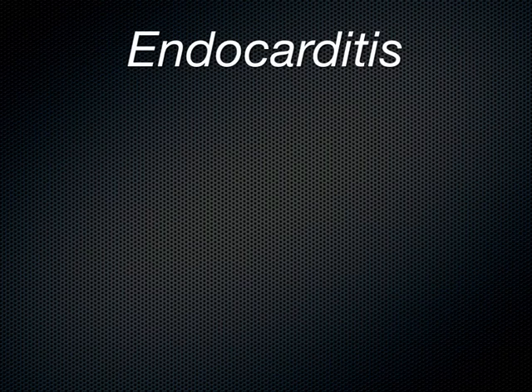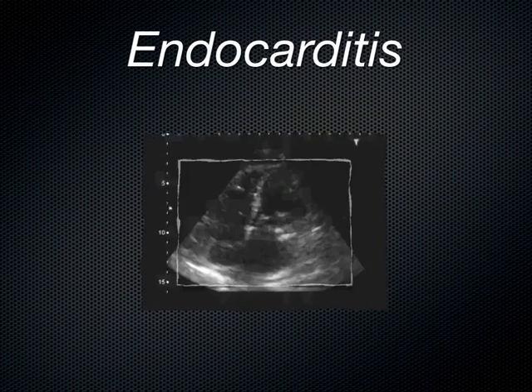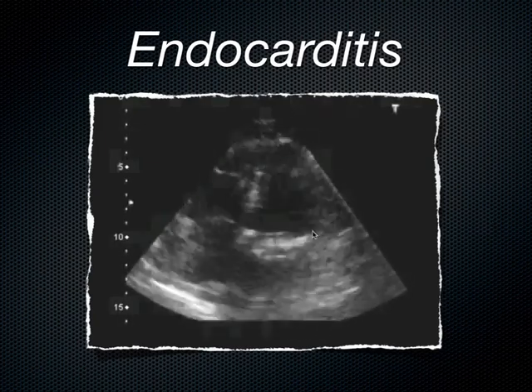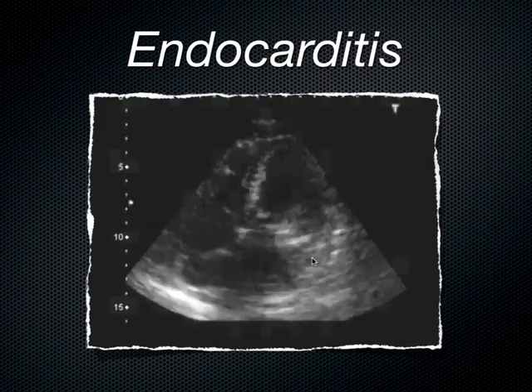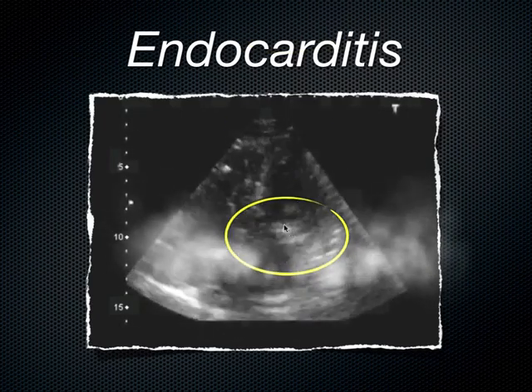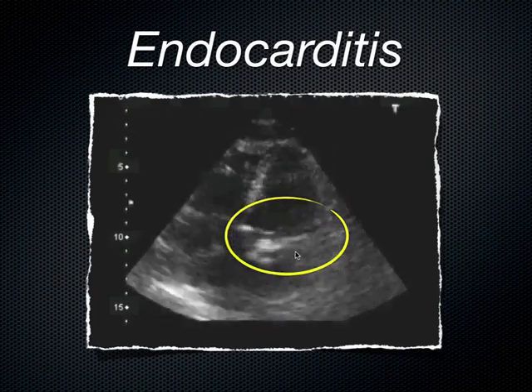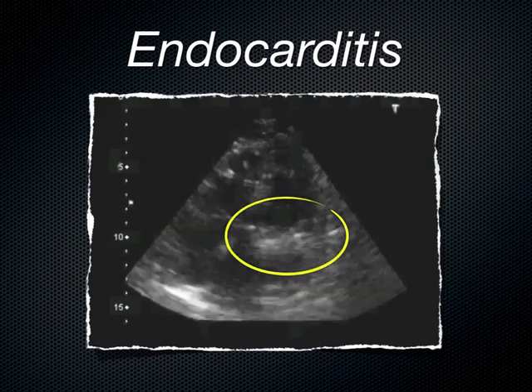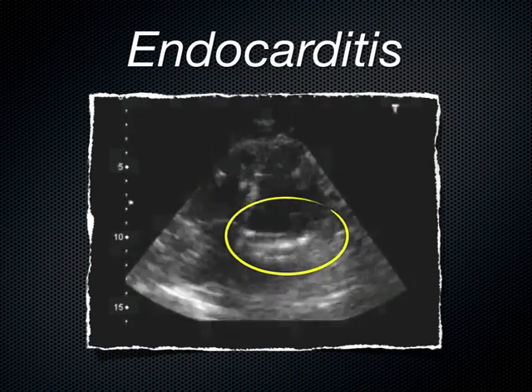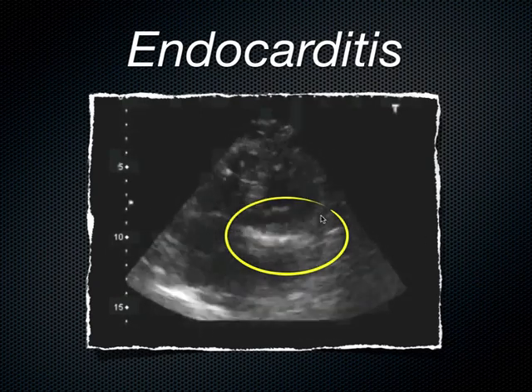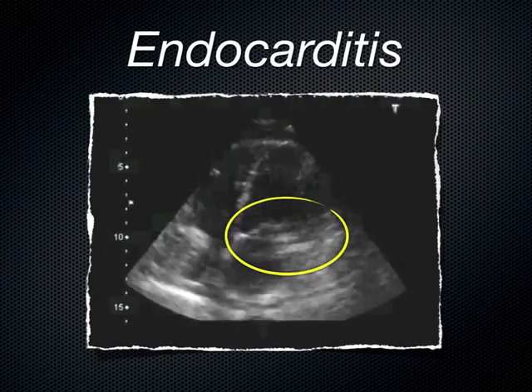Moving on to another cause of fever: endocarditis, where one of the heart valves actually gets infected. This is most commonly from using IV drugs, where bacteria gets into the blood and makes its way to the right or even left heart — most commonly the tricuspid valve, but occasionally the mitral valve. This is a case of a mitral valve with a vegetation on it — we can see this vegetation right here, attached to the mitral valve. This is the apical four-chambered view in a patient who has endocarditis.